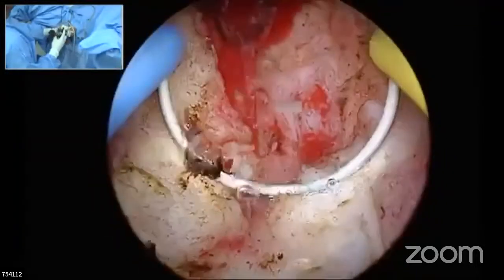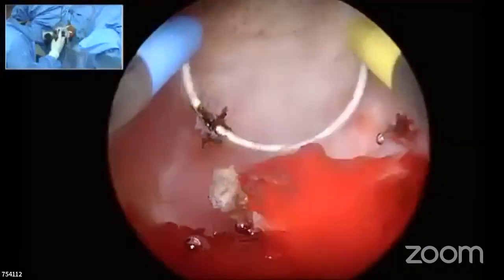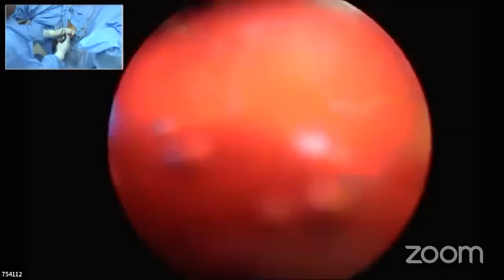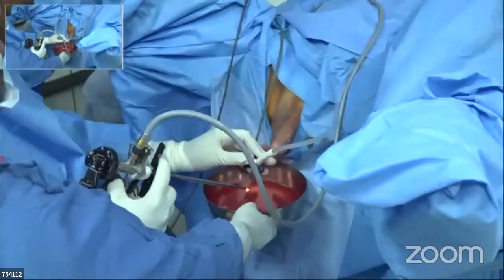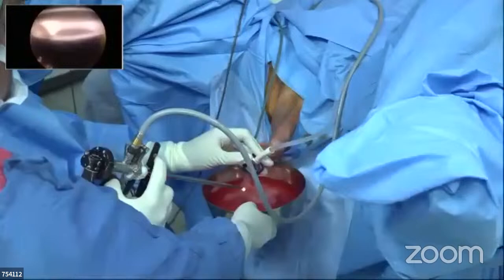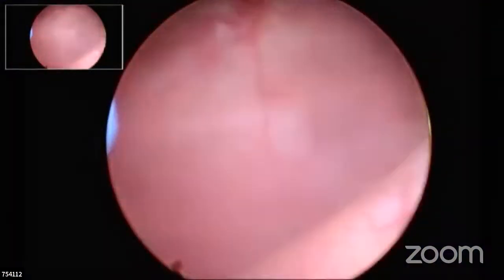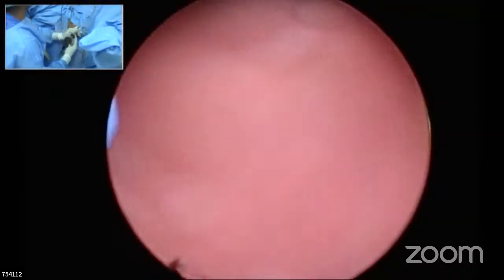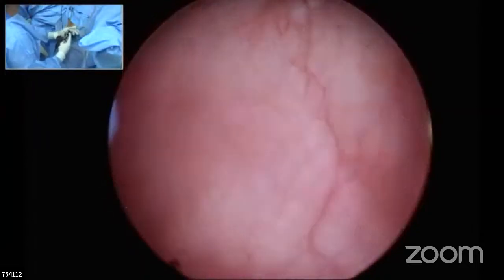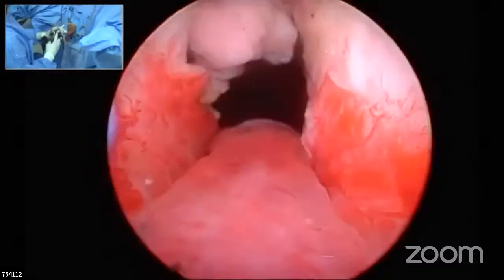Before coming out, I normally shut the inflow, keep the outflow on in my instrument, and that often shows you small bleeders and chips which have not been seen so far. Yes, exactly. So when you stop the irrigation and see, and the outflow is on, you will be able to see if there are any venous bleeders which you missed because of the high pressure inside the bladder. Am I right, sir? That's correct. Yeah, that's exactly it. So I'm looking for those pieces. I don't see any pieces. I don't see much bleeding inside.